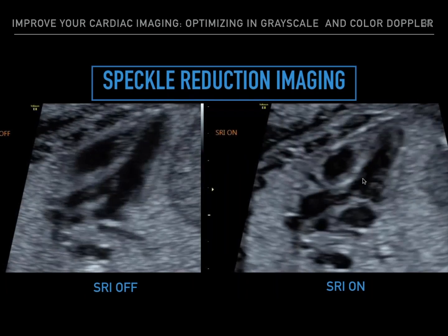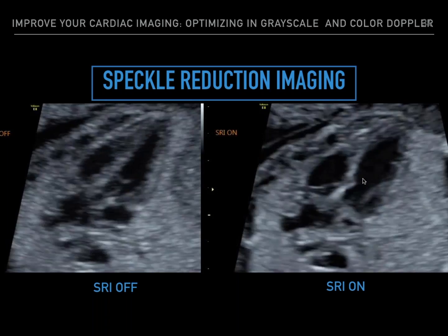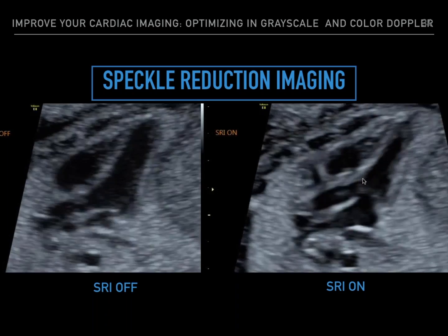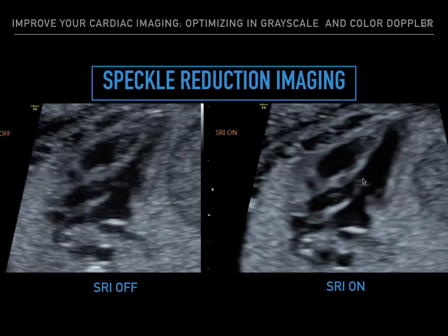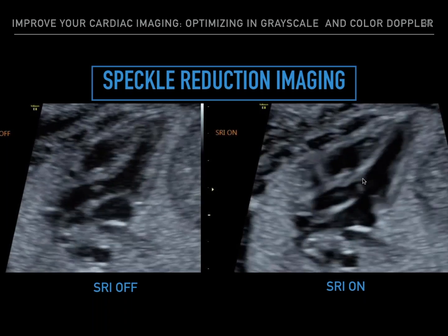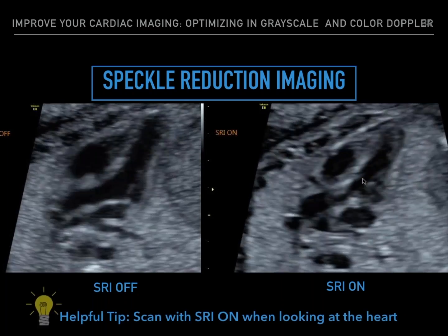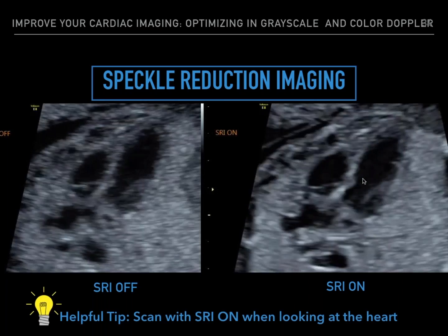So here's an example of speckle reduction imaging off and on, and we are looking at the left ventricular outflow tract. With SRI off, we see some striations along the interventricular septum that make you think, well, is there a suspected ventricular septal defect in that area? But when you turn SRI on, you could see the smooth, nice walls of the interventricular septum. So helpful tip, you want to scan with speckle reduction imaging on when looking at the heart.